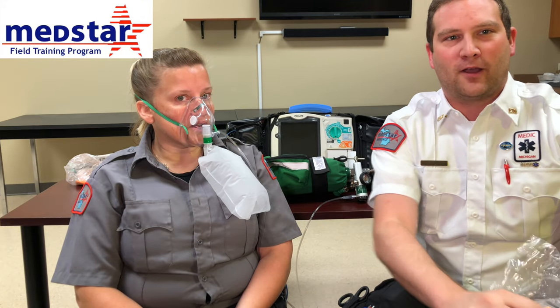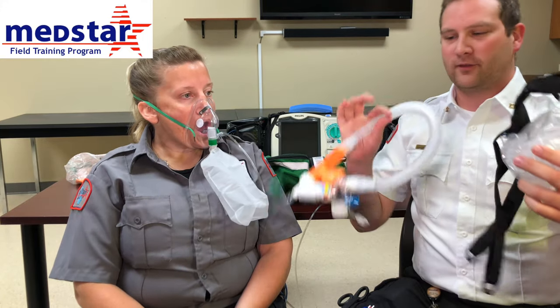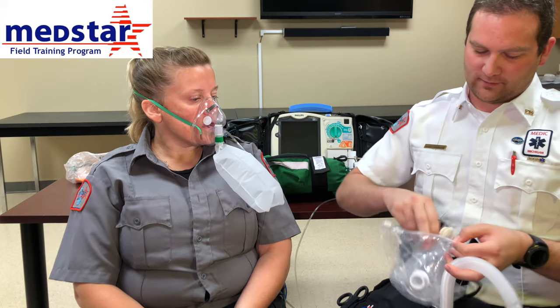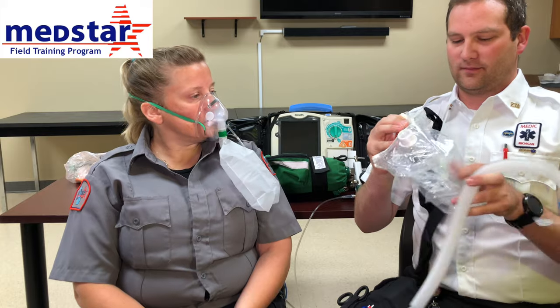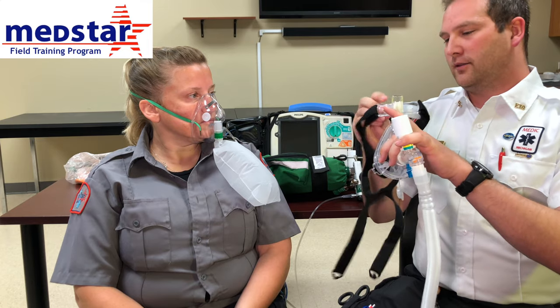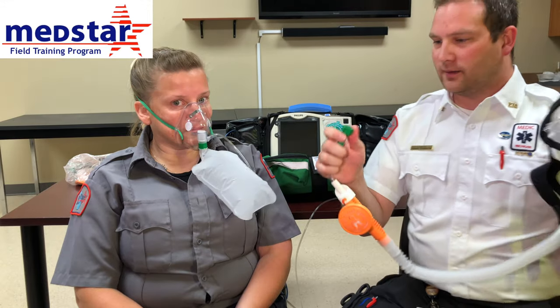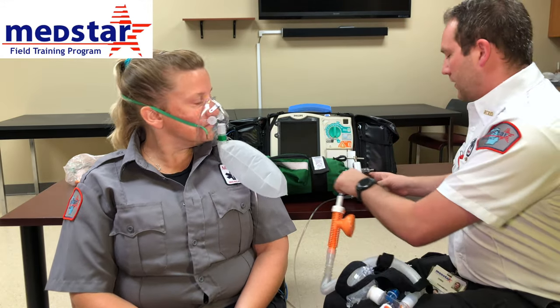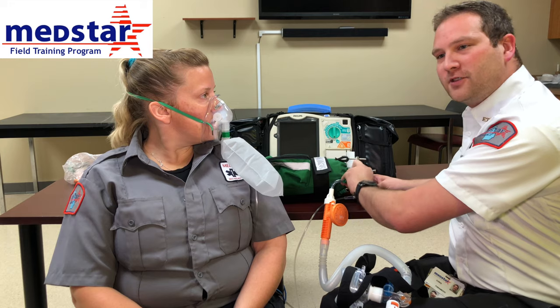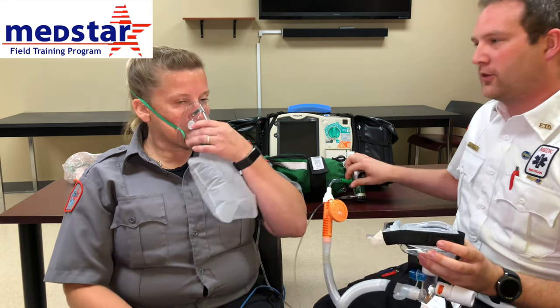Open the package and take your CPAP out. There are a couple of different components: the mask and the tubing. The mask is quite simple — just plug it right into the CPAP tubing. Then plug the tubing into the oxygen tank by taking the end with the green piece and screwing it into the high-pressure valve. As long as the tank has oxygen in it and is open, when you screw this in it should automatically turn on at the correct flow rate.